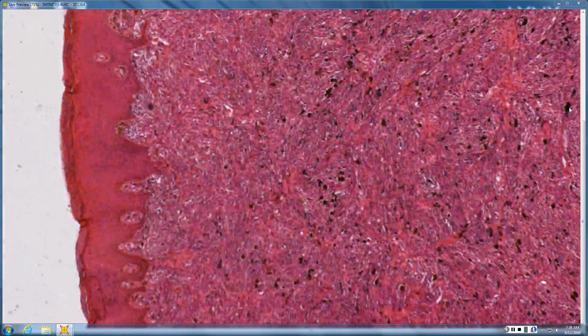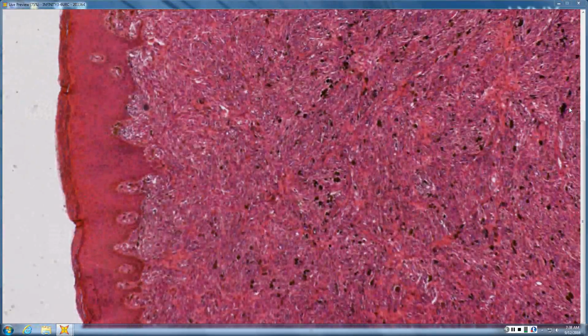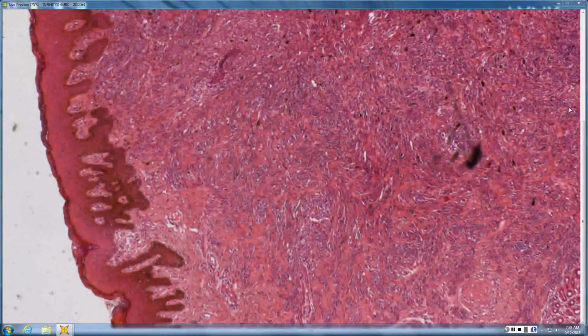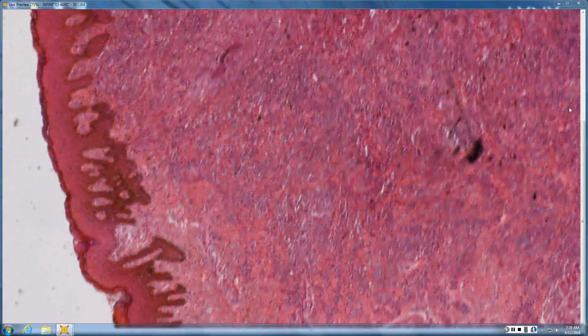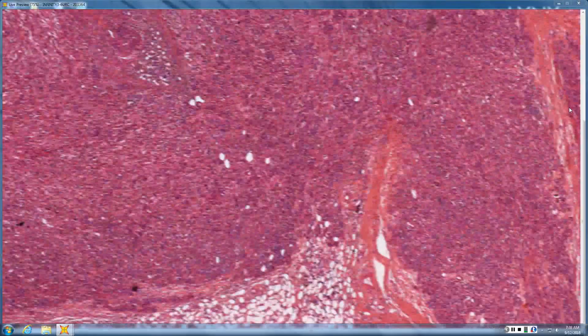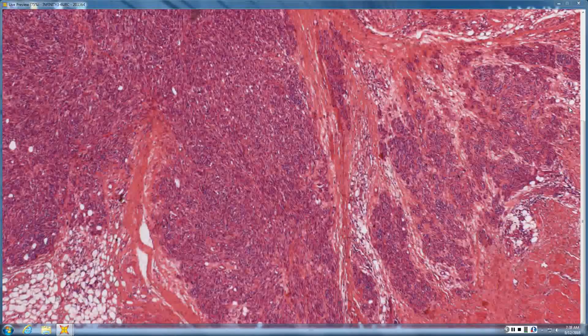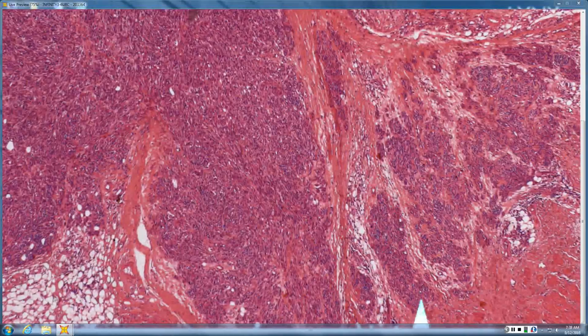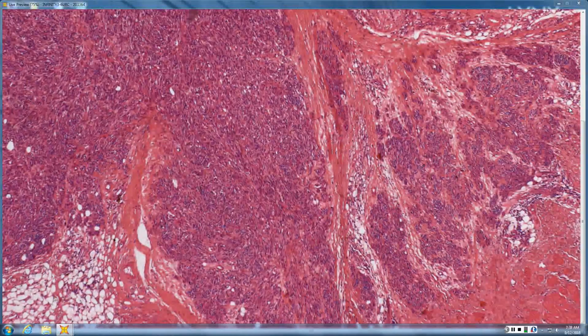Okay, Kendall, what do you see here? So the epidermis looks very pink, maybe some pigment down at the tips. But then really in the dermis, it's kind of busy. There's a lot of pigment. It doesn't really seem to be maturing very well, kind of going into fat. And when you get down to the base, see how they're long, parallel thecae, parallel to the surface? That's always melanoma when you see that.